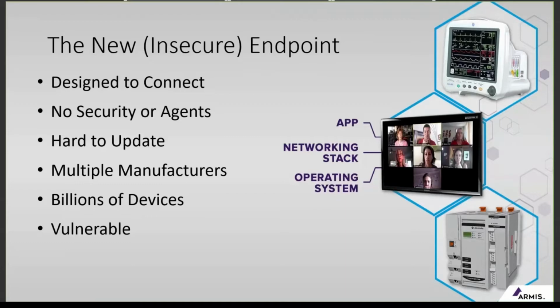Again, similar from the perspective of they all have an operating system, they all have software that allows them to connect to other devices and networks. But where one of the other similarities applies is in how devices are compromised. How a laptop is typically compromised, how a mobile device is typically compromised, is through those things, through the operating system, through the software that allows them to connect over networks. The differences are that IT's been managing these devices for decades and in turn has operationalized processes, and has built tools that can be installed into these devices, like antivirus solutions, that are looking for attacks, responding to those attacks, preventing those attacks, etc.